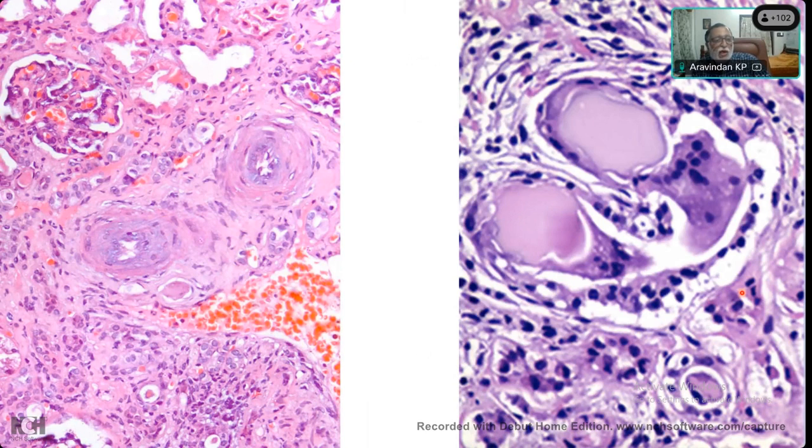The first one, anybody would like to make a diagnosis? Do I have to give it as multiple choice? There's no need, they can type in the chat box. Okay, the answers are coming. TMA I can see. Yes. Malignant hypertension. TMA secondary to malignant hypertension.